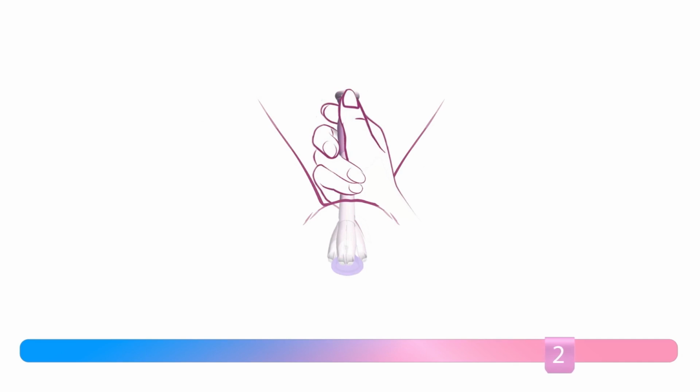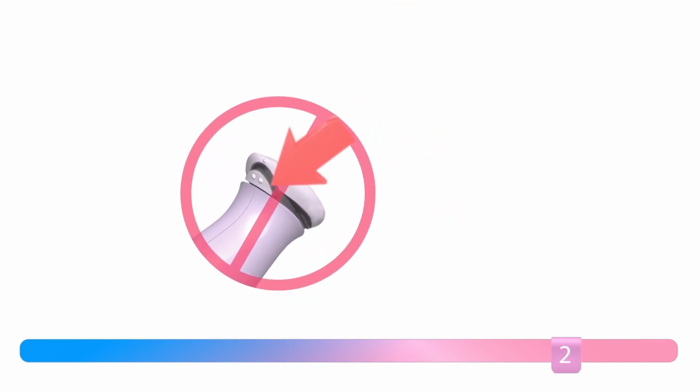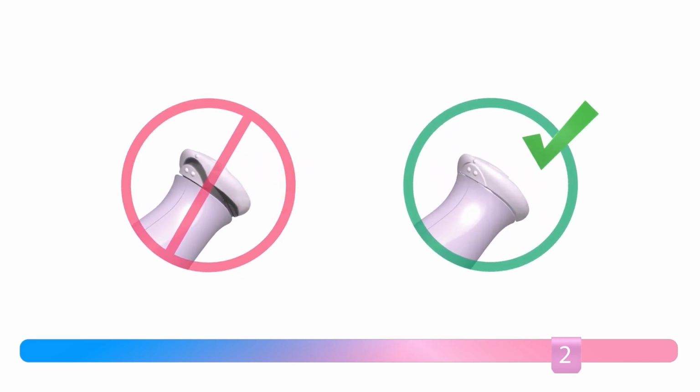The plunger should advance forward. If it doesn't, finish pushing it down until it is flat with the device. This allows the cap to be opened at the cervix and also allows you to make final adjustments prior to releasing the cap.